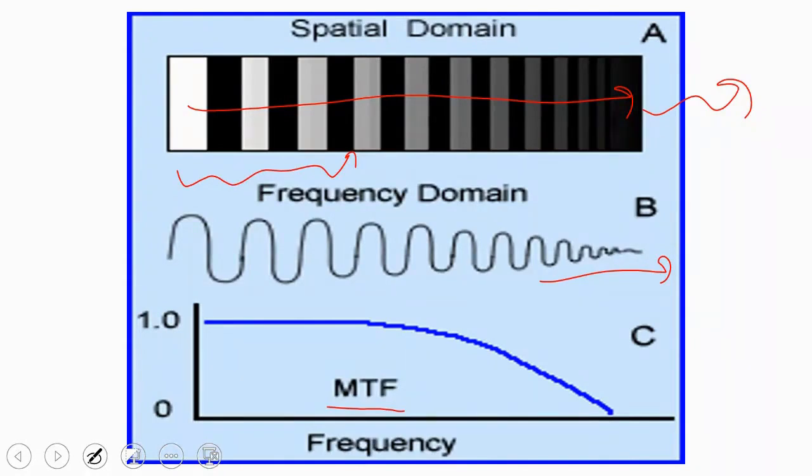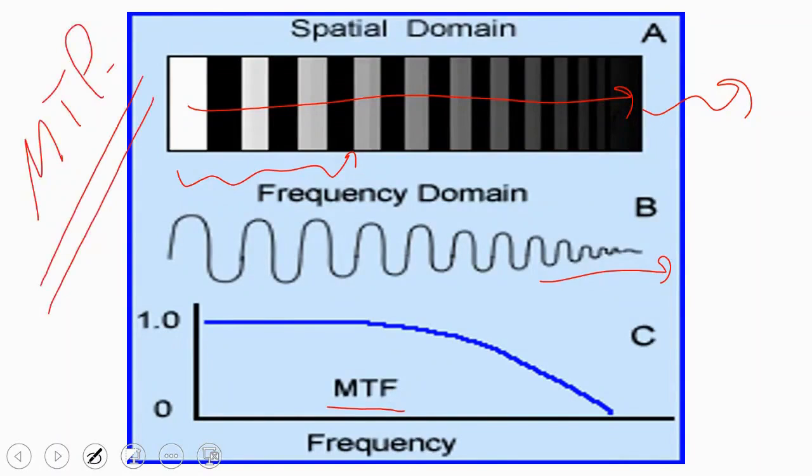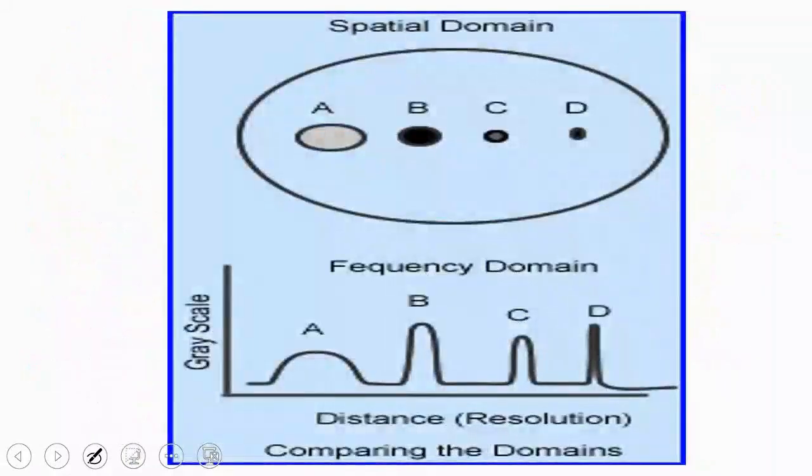So, the value of the MTF, which is the modulation transfer function that we were talking about earlier. Do all the doctors with us know about the topic of the modulation transfer function, MTF, or not? Oh, right. In the part about low frequency, you find a high value here, 100%. Then, when you move to high frequency, you see that your modulation transfer function, MTF, is decreasing. The same idea applies here if you have objects A, B, C, and D present inside this patient.